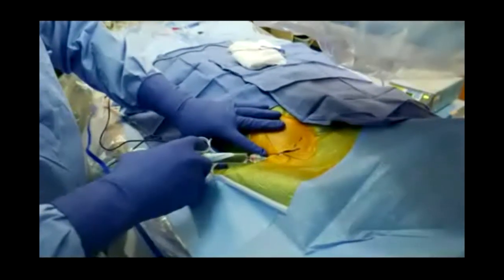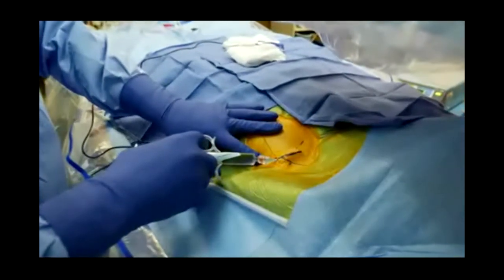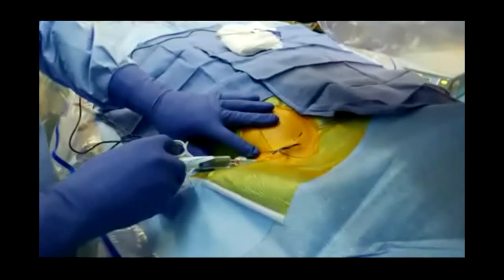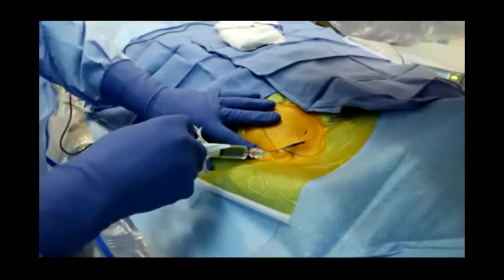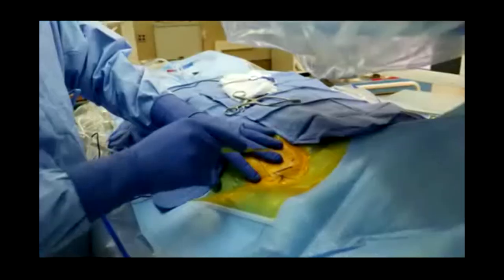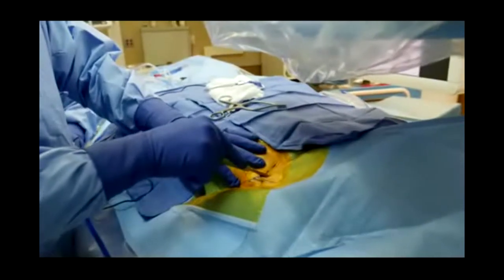We use 5 to 10 cc's total, a copious amount to ensure complete patient comfort. There's no need for the patient to feel any discomfort of any kind at this point. So we numb the skin thoroughly, and that is what we're doing here along that planned incision track. And there is sharp dissection along our planned incision track.